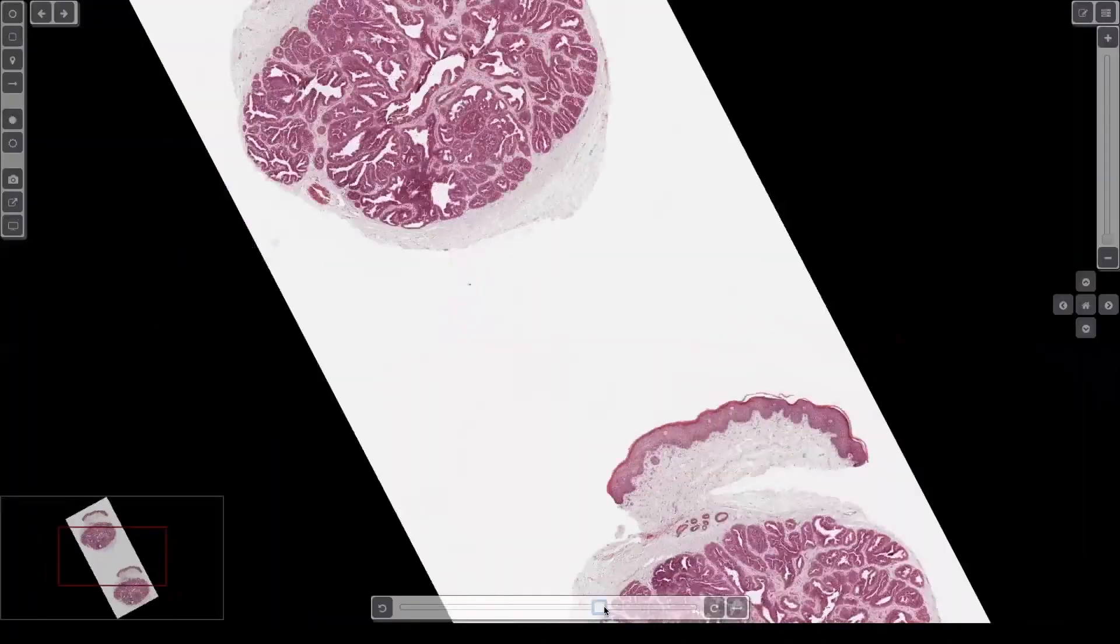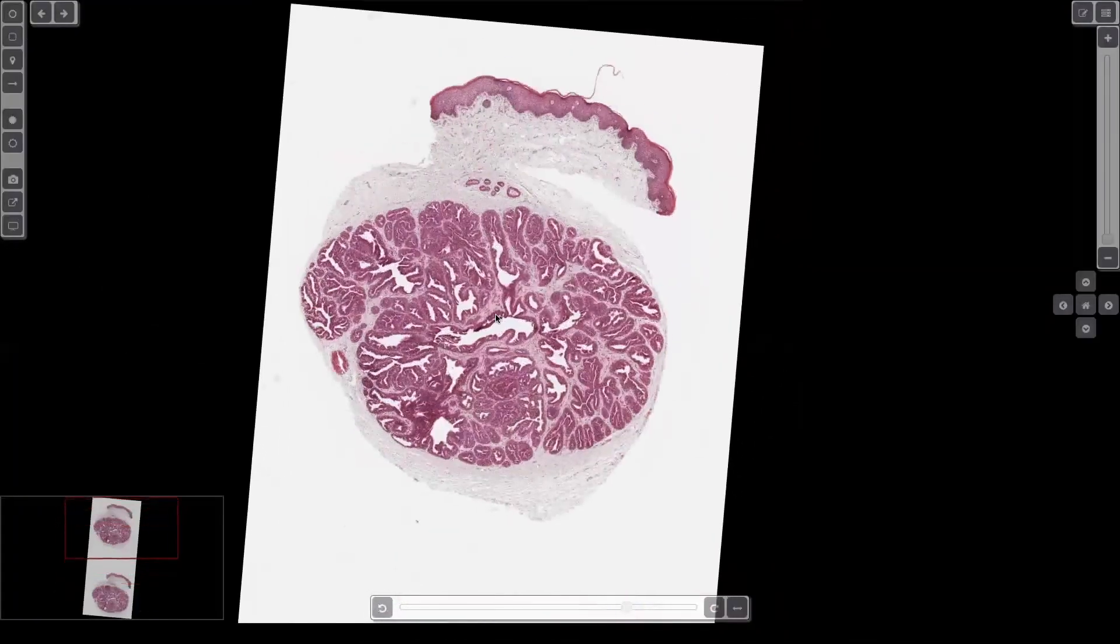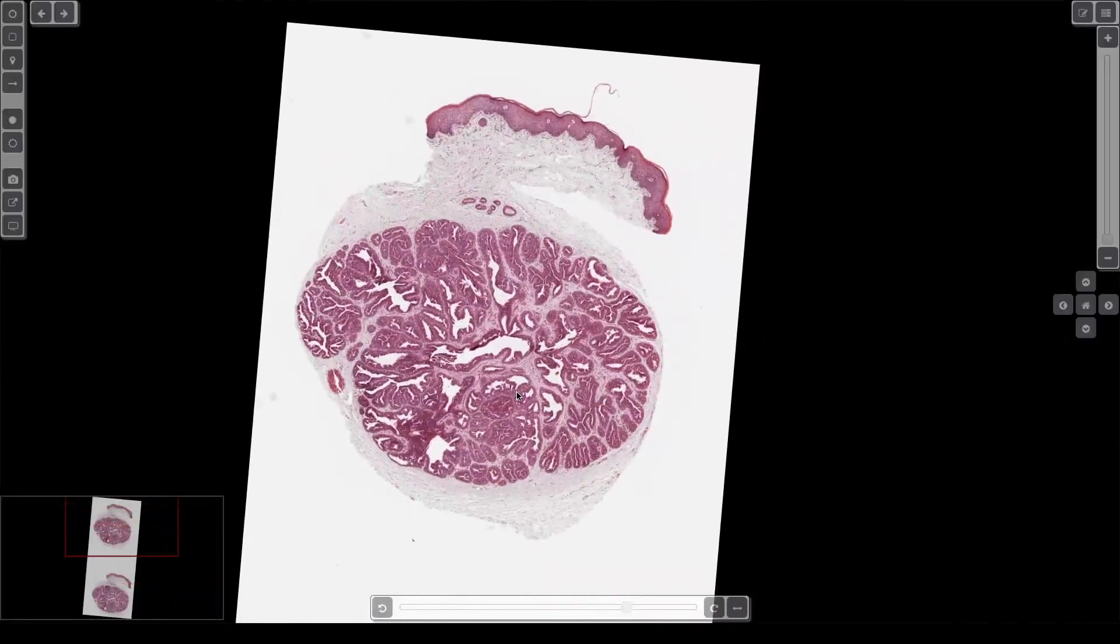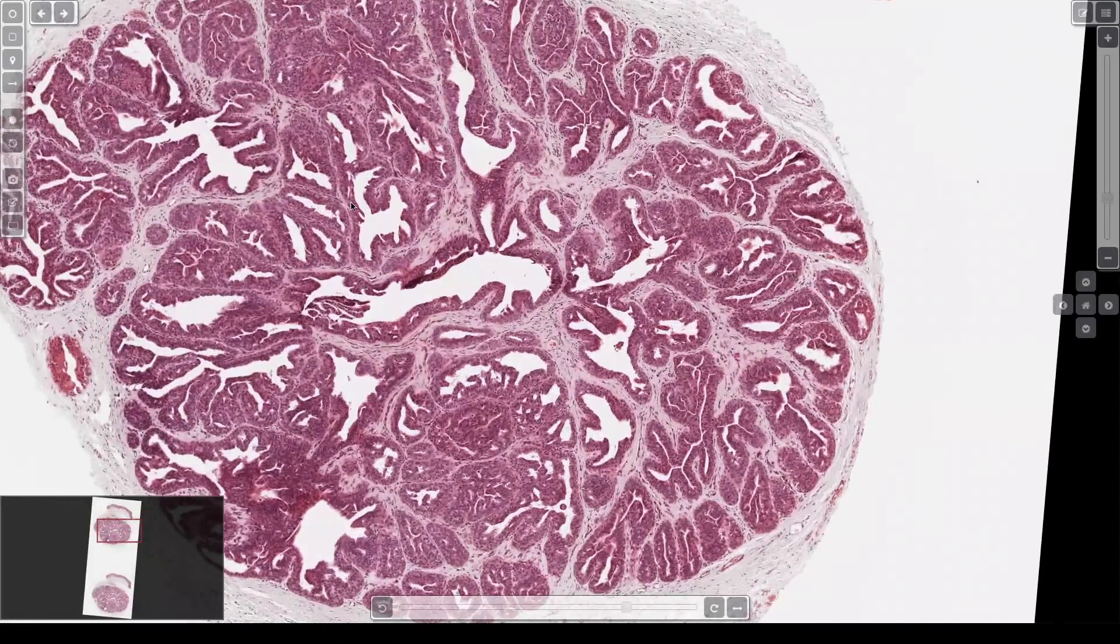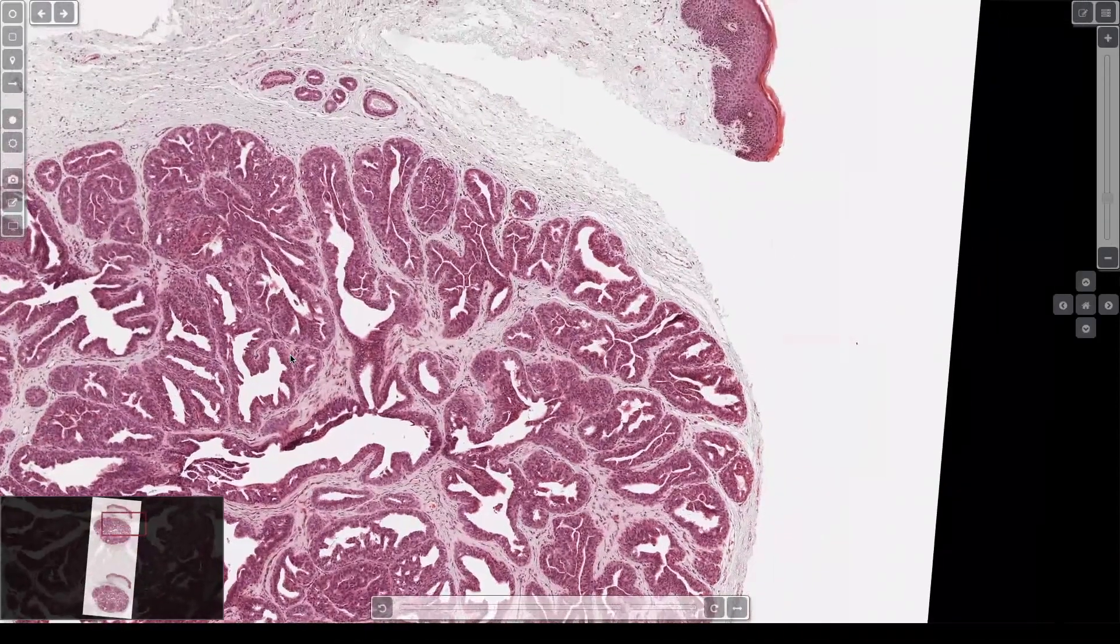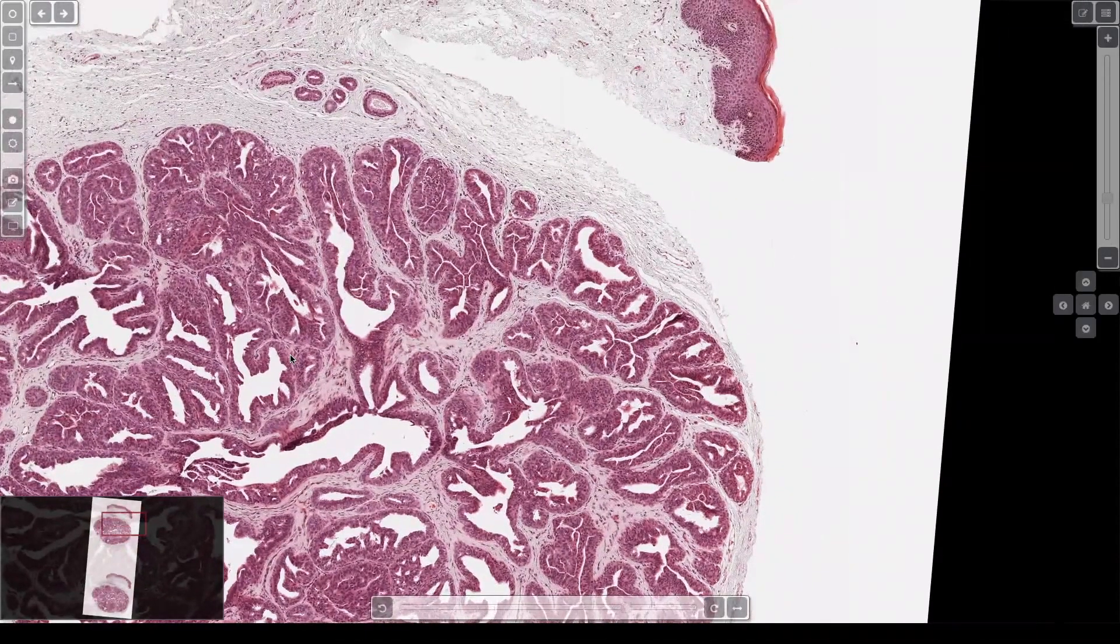And here is a lesion that's a nodule down in the deep dermis, relatively circumscribed and it's got cystic spaces and lots of papillary structures folding into the middle of the cystic spaces.